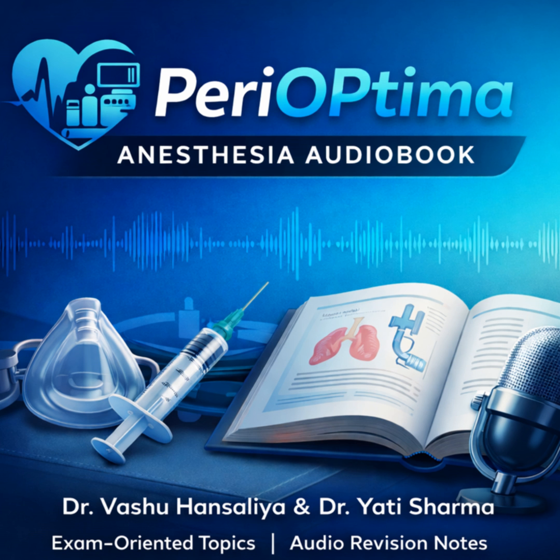So what's the clinical why here? Why is it so important to fight this, especially in a high-risk patient like a trauma case? The sources are absolutely clear on this. Hypothermia increases mortality after major trauma. Full stop. So by conserving the heat and moisture that would be lost through the lungs, we are directly fighting a known cause of bad outcomes. And we do that with either active humidifiers or, more commonly, passive humidifiers, the heat and moisture exchangers, or HMEs.